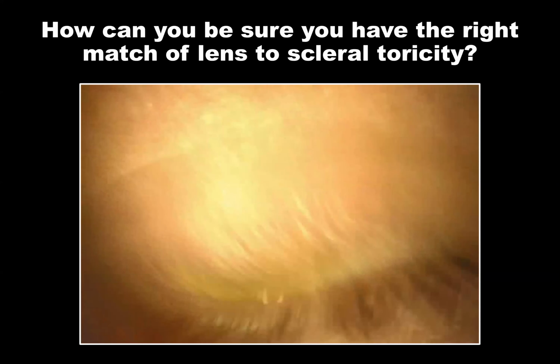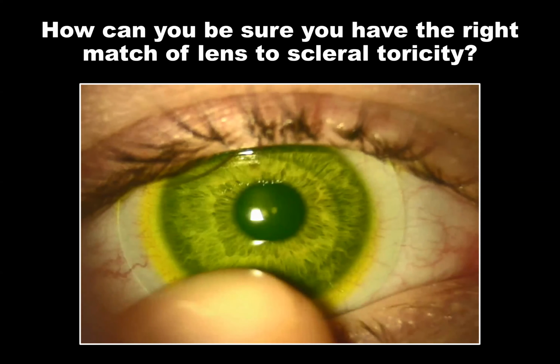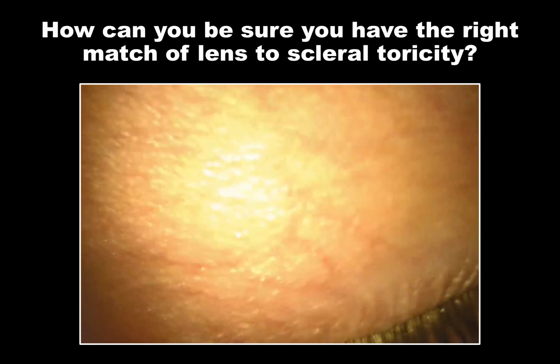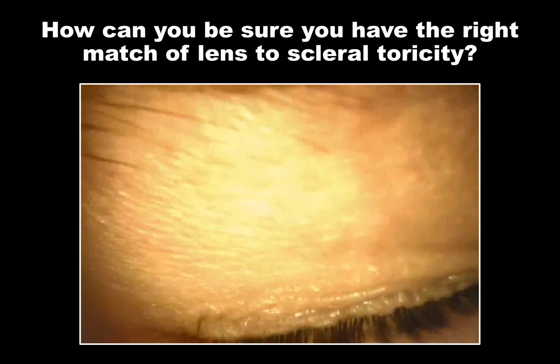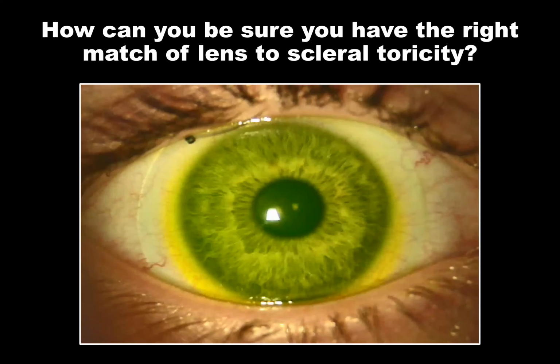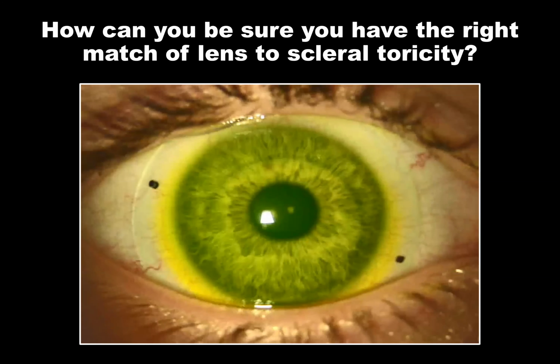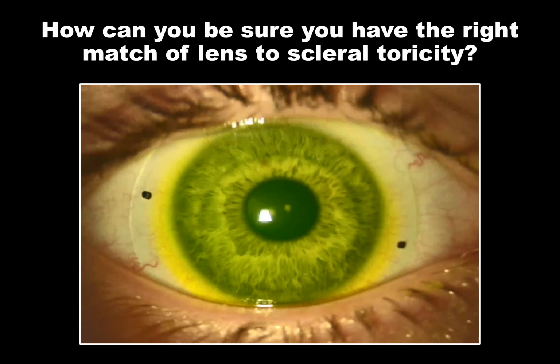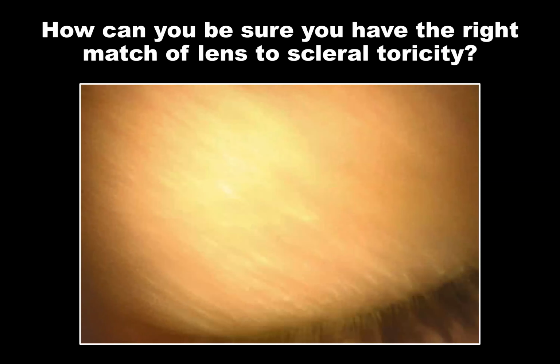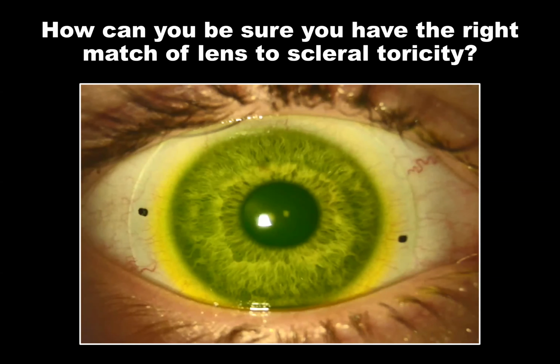I am not sure how to answer that question exactly, because when I put my finger on the lens and rotate the lens off axis, I'm probably altering the pressure of that landing a fair amount. And some patients will say that they can feel that. They can feel when I rotate it. But when you take your finger away, I don't think patients can feel that rotation.